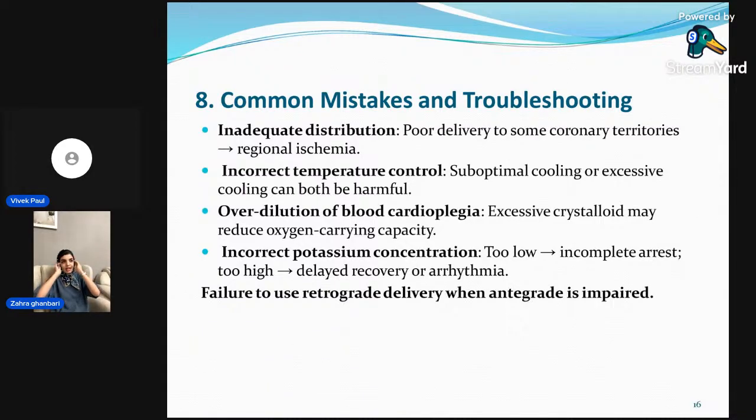And another factor that we consider for hemodilution is SvO2, or mixed venous oxygen saturation. The goal is to maintain this around 65 to 75%. It is the oxygen level in blood returning to the oxygenator. And another factor is lactate level. Our goal is to maintain this at less than 2 millimoles per liter. And by interpretation of ABG, we can calculate hemodilution. There are some points; I think it's not bad to say them.